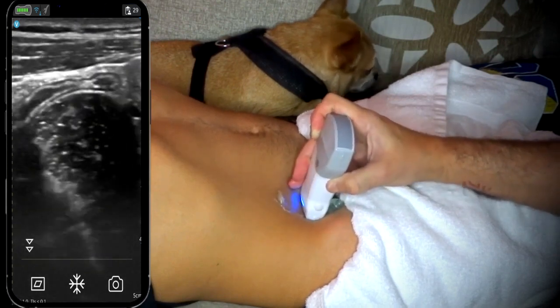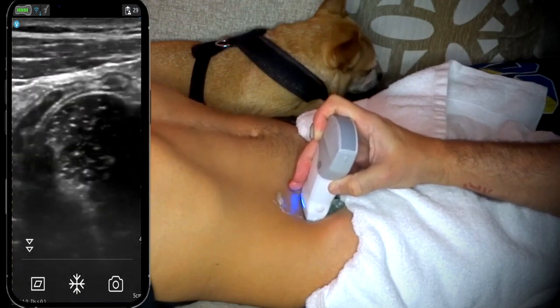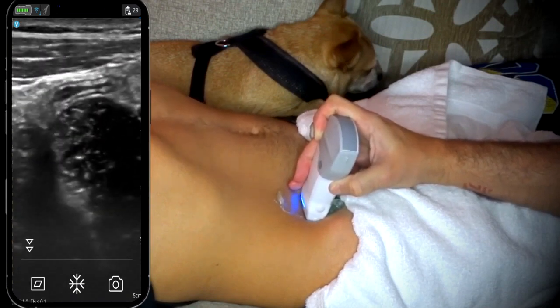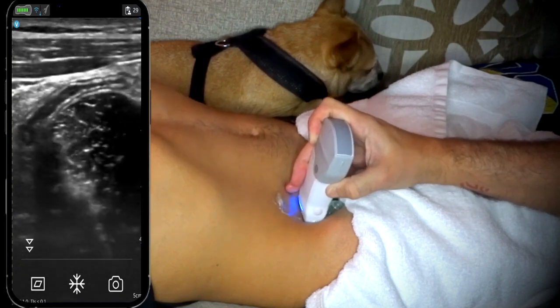So this one's draped right along the psoas muscle. All right. Very normal. Congratulations, you don't have appendicitis, bro.